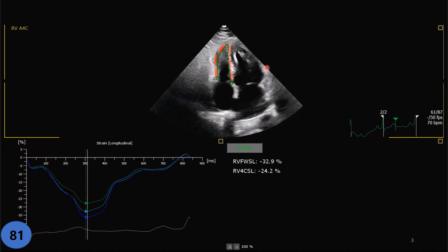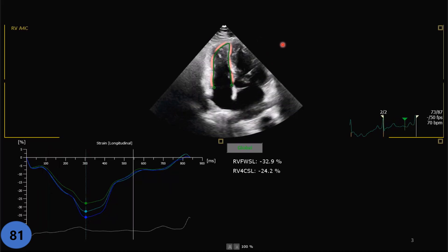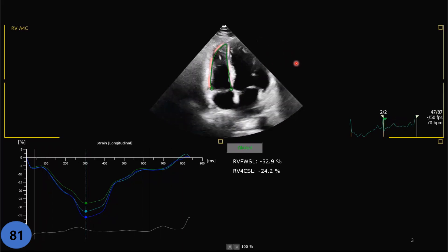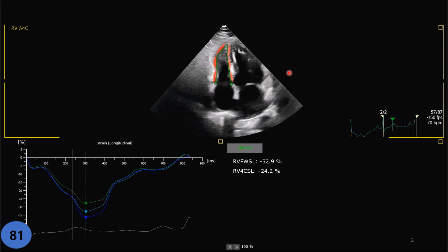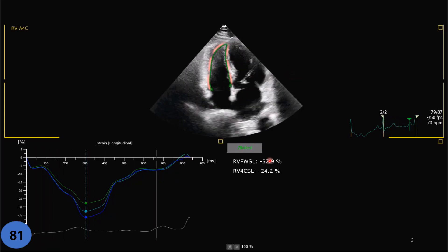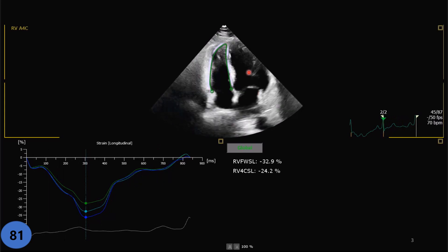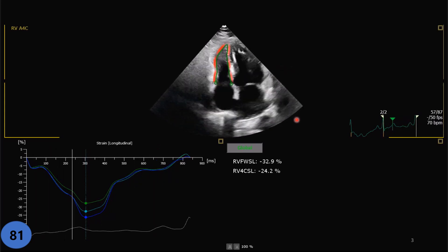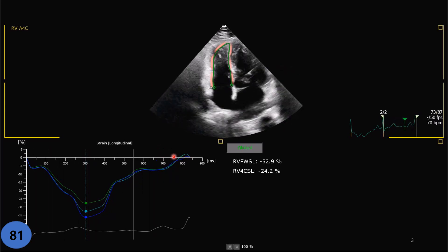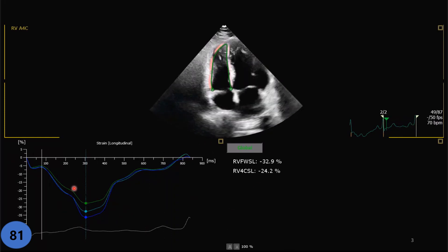During the cardiac cycle, verify the trace is correct. If not, adjust it — use the same technique that I explained in the LV strain video, go check it out. When you are satisfied, click accept and acquire.